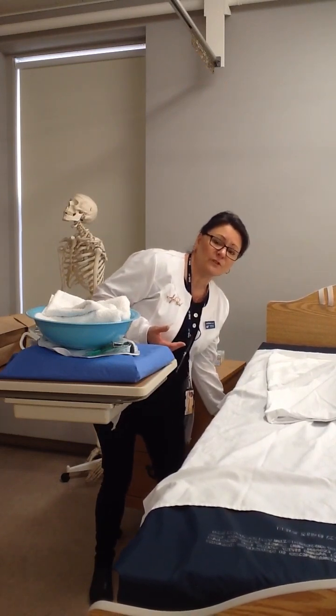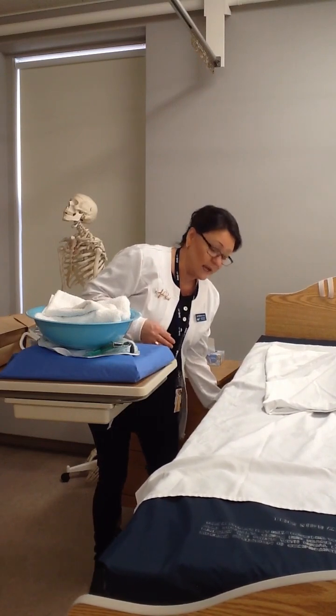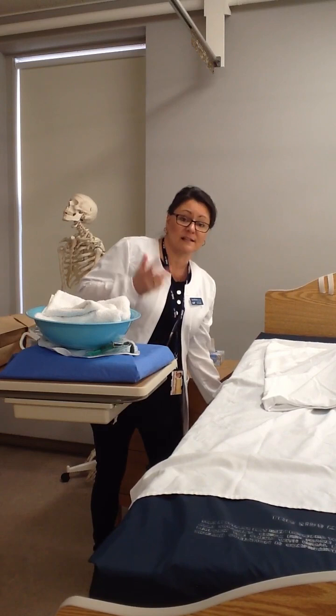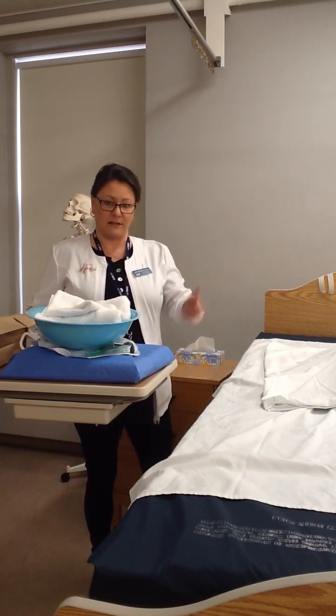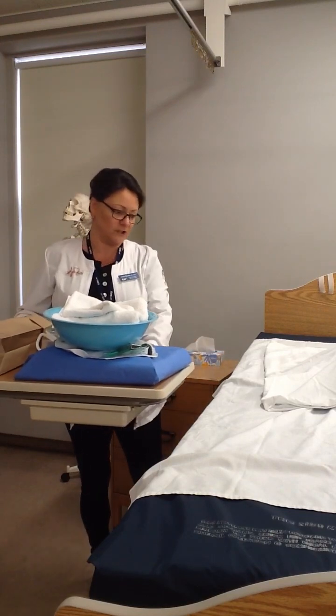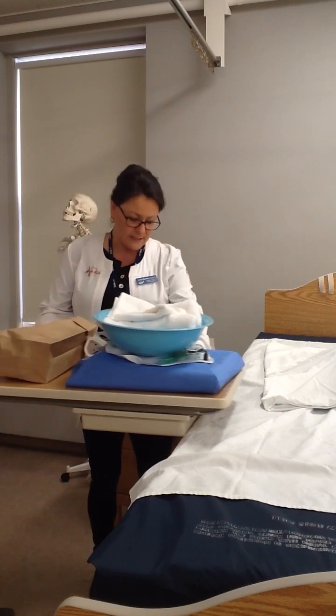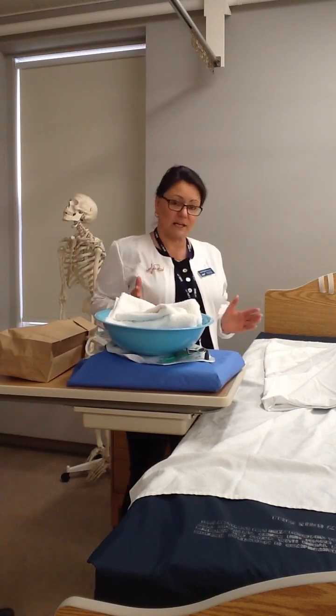Some procedures that we're doing, whether using sterile technique or not, are about good body mechanics. So there are two reasons for us raising everything up nice and high. We don't want to be bent over when we're providing care for our patients. So I've got everything nice and close, and then you can see that I've created this triangle of success that you hear me keep talking about.